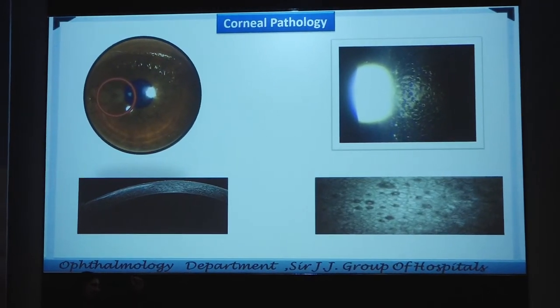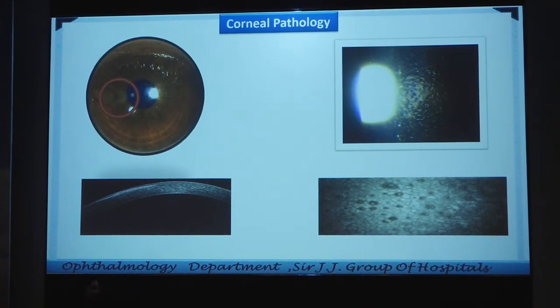So, corneal pathology. Yes, there is a corneal pathology. Is anybody operating phaco? Then they say, no, do the illumination from inside, illumination from outside, inside illumination, then retro illumination, but do the phaco. Oh brother, why do you do it? Do SICS, no illumination is required, but the patient's vision is illuminated.